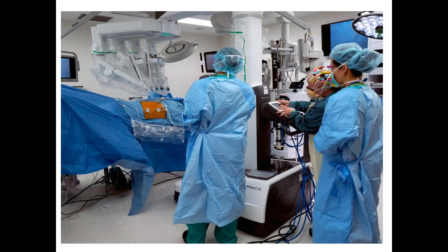That's another way. Now, what is added to the minimal invasive surgery here is that the robo is doing the surgery. If you look at the picture, this is what I was talking about. You can see this port, which has a central hole here. I'm pointing to this, through which those slender instruments are going to go. So in these holes, the pointed trocars are going.